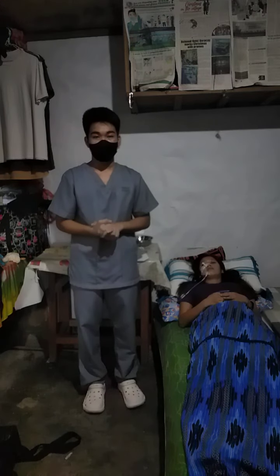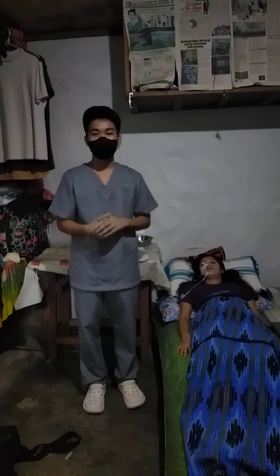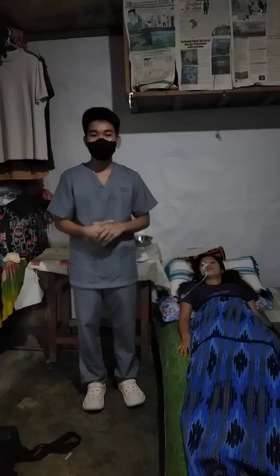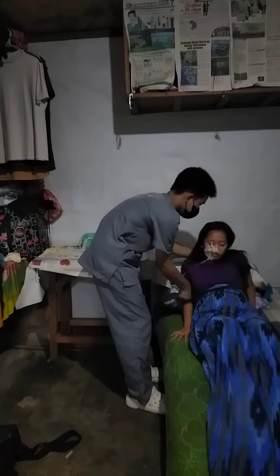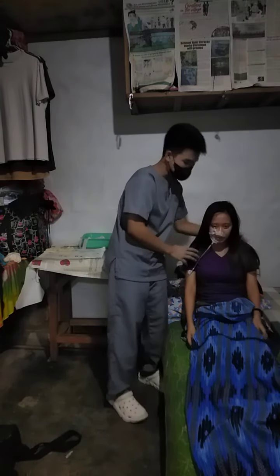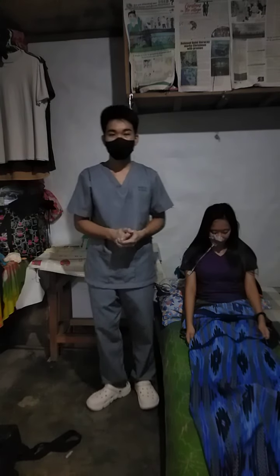Next, position the client in high Fowler's position unless contraindicated. This reduces the risk of pulmonary aspiration in the event the client vomits. So ma'am, position lang po tayo. Okay lang po, ma'am. Komportable po kayo. Then, don clean gloves. This is to prevent the transmission of microorganisms.